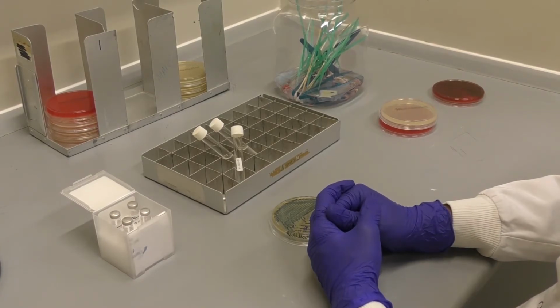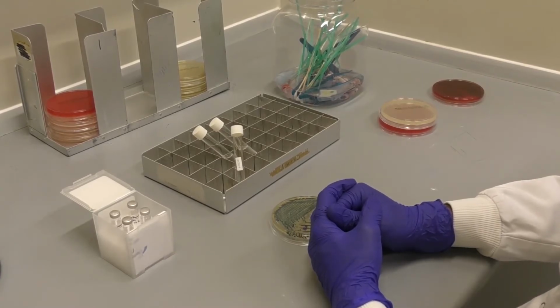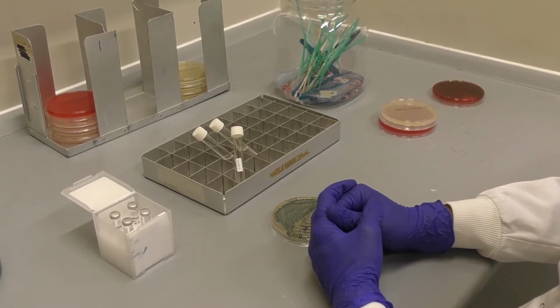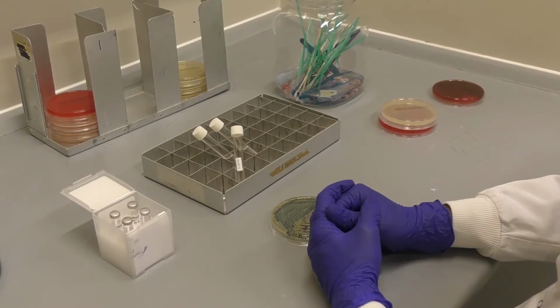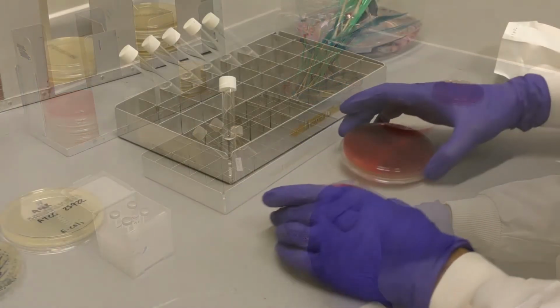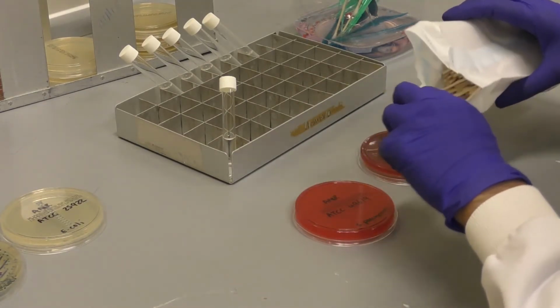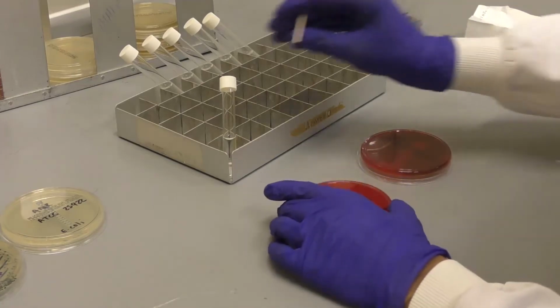Now, once the suspension is made, you will progress to inoculating the room temperature agar plates. Plates must be labelled with a permanent marker with the bacterial isolate ID, specimen number, and AMR or E-test to indicate that this is an E-test plate. The control plates must be labelled either ATCC 49619 control strain for Streptococcus pneumoniae, or for E. coli use ATCC 25922. Labels can also be printed if this is an option.